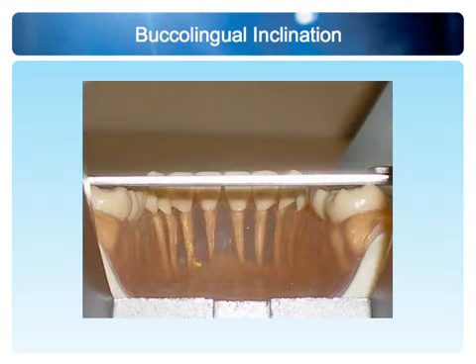And here it is from the lingual view. And so, if we have the lower teeth upright enough, we can see here we miss by 1 mm. Our typodont model measured 33. Remember the transverse measurement of the upper arch of our typodont model was 33? If it was 35, then the upper molars would be 1 mm wider on each side. And if this was 1 mm up on each side, we would be getting closer here. So, hopefully you can see the pieces of the puzzle starting to fit.